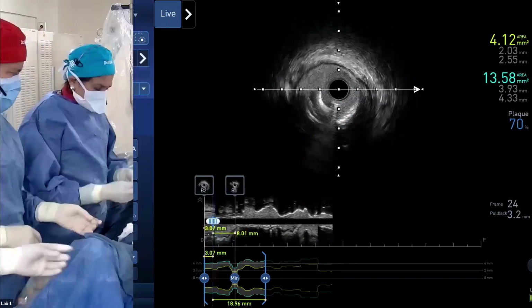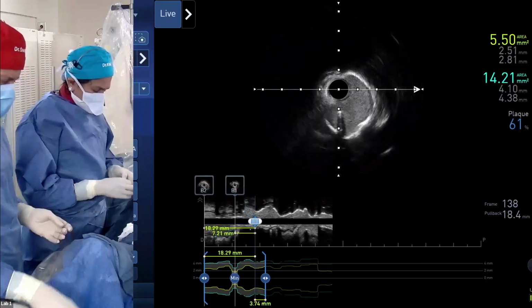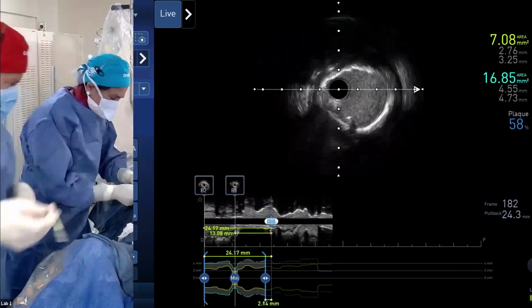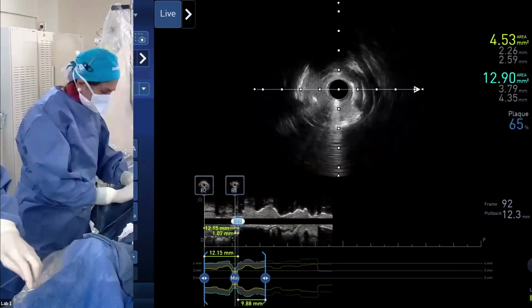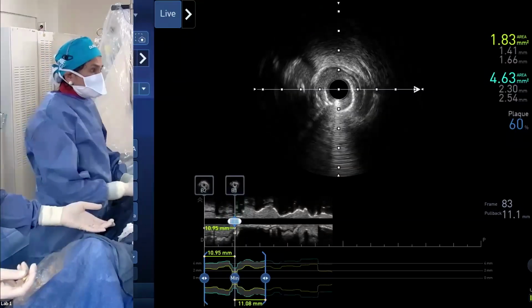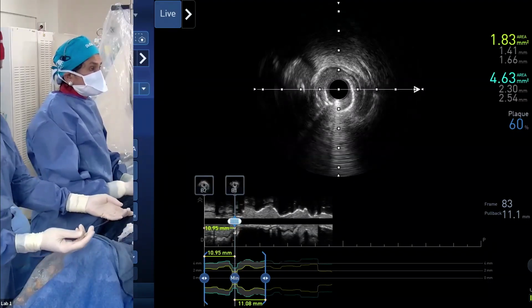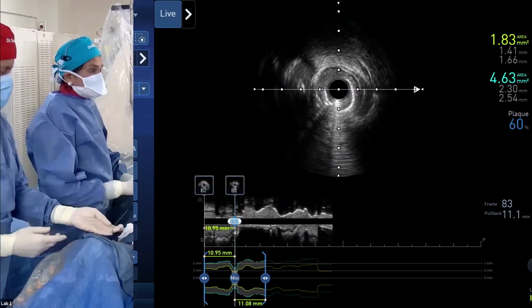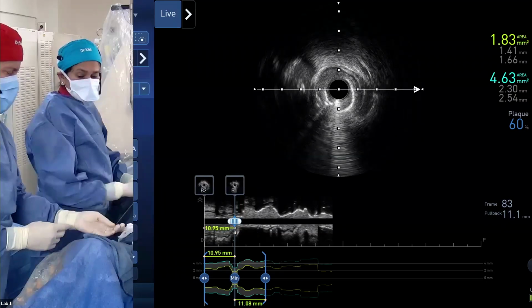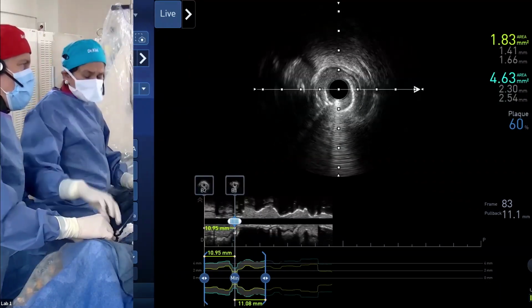This is a very complex bifurcation, like a huge chunk of calcium, as complex as it gets. It's a two-stent strategy, obviously. But if you do IVL in this, we've seen that if you do main branch IVL, the fracture and stuff sometimes jails the diagonal so badly that it can actually shut it down. So you have to be very careful if you're just thinking that you may be shocking the ostium and sometimes fracture, so it'll be easier to cross.